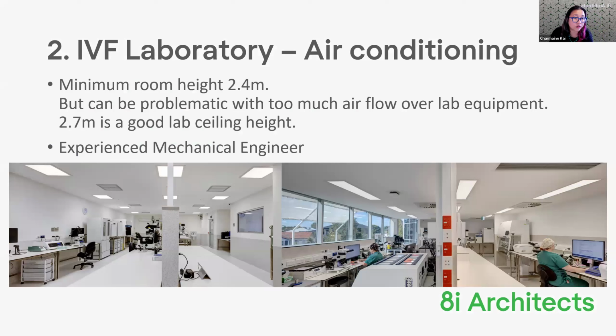So also in terms of air conditioning, that's the more technical side of air conditioning. And I'm not a mechanical engineer, but over the years of doing this, I've learnt basically all the key elements of things to look out for when designing the lab. So I can check and help my client educate the engineers in terms of what we need to do for the air conditioning requirements for the lab, because it is quite specific for an IVF lab.